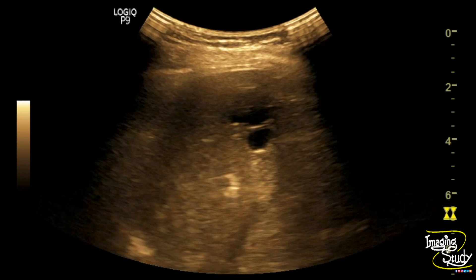Here's the picture. You can see the complex cystic area with internal hyperechoic thin septation.